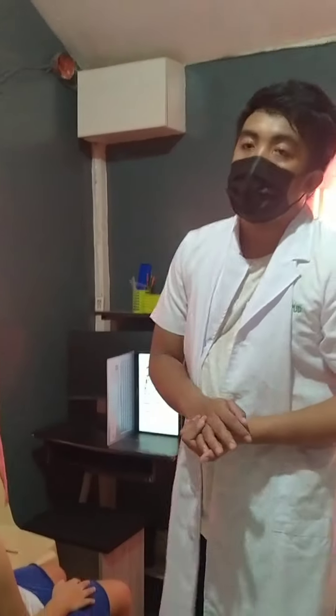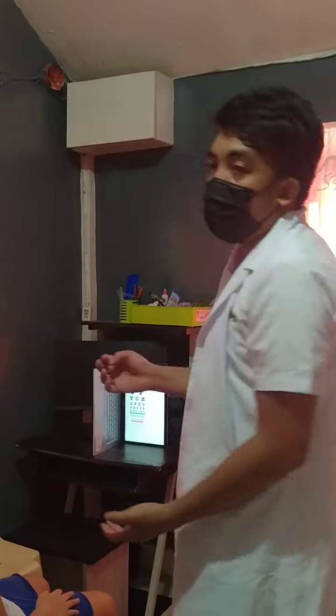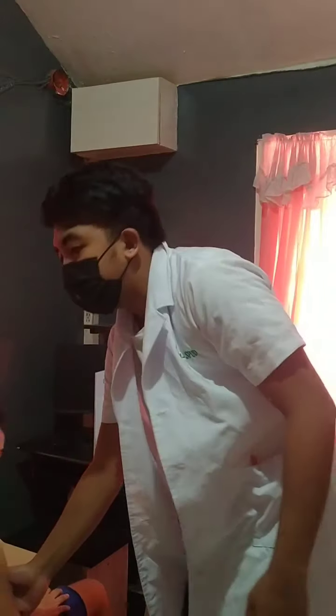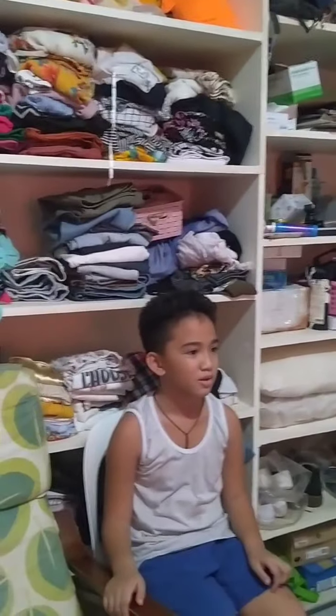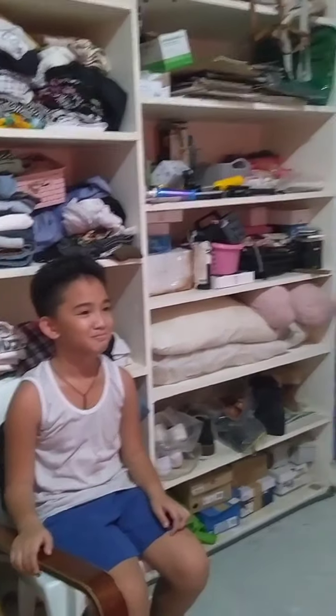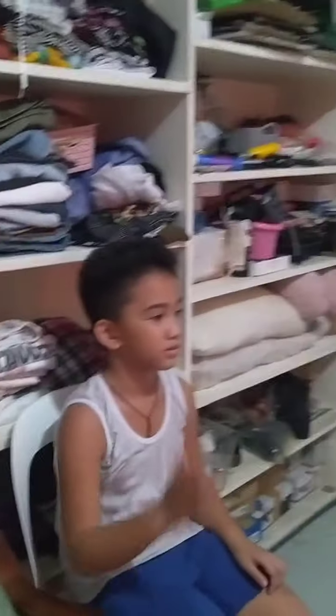Then, the next thing we'll do is the distant vision test, the far vision test. Let the patient stand 20 feet away from the Snellen's chart. Sir, let's move back, sir. Just sit here, sir. And let the patient read the Snellen's chart. Sir, let's start. Tell me which letter I am pointing at, sir. Then cover your left eye, sir.